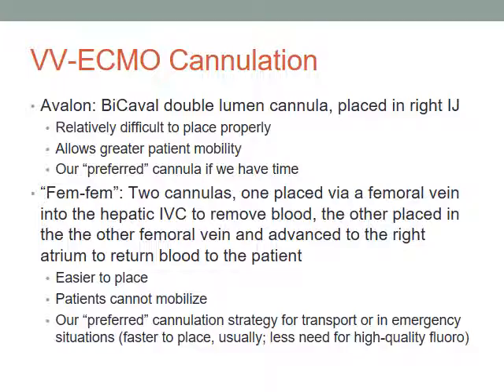It's relatively difficult to place properly. It does allow greater patient mobility, which is really nice. You don't have to put things in the groin, which is really good. And it's our preferred cannula if we have the time and the anatomy to facilitate it. Okay? Now, our other standard VV approach is what we call fem-fem.